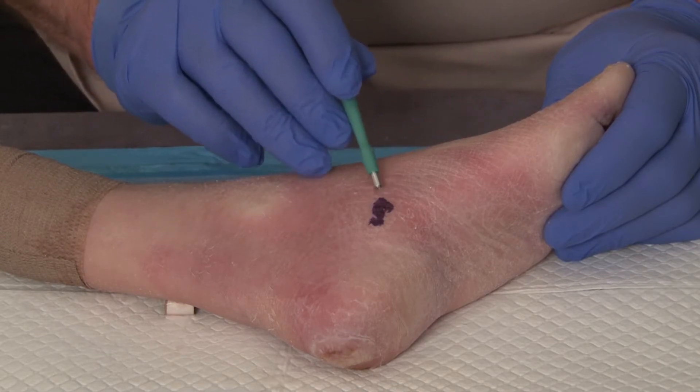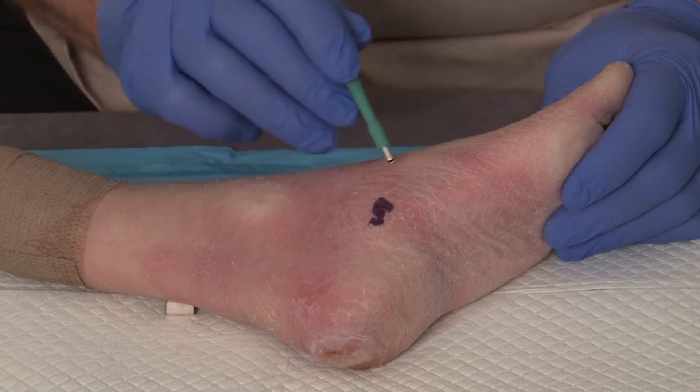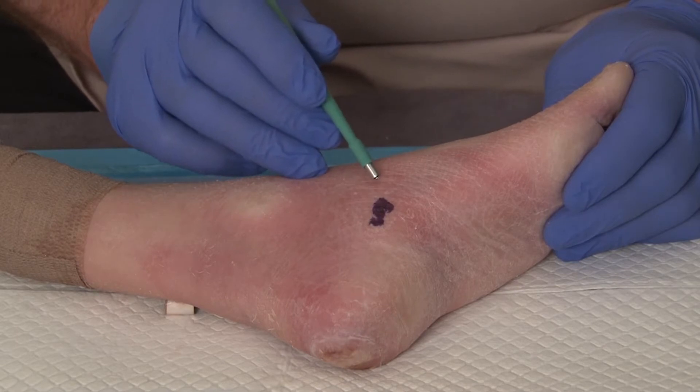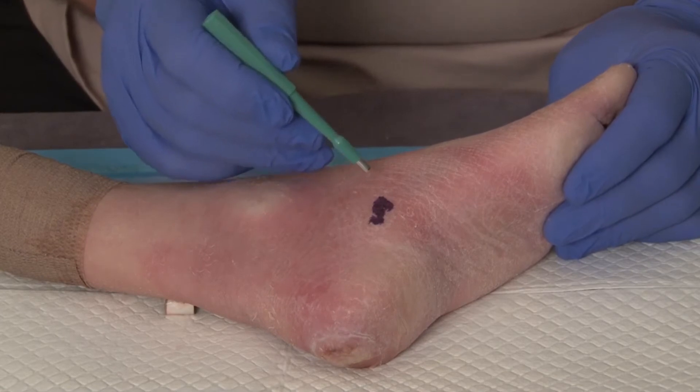Prior to actually doing the biopsy we would prep the skin with an alcohol, raise a small wheal with a local anesthetic injection. Once that has been done, then we will consider doing this part.